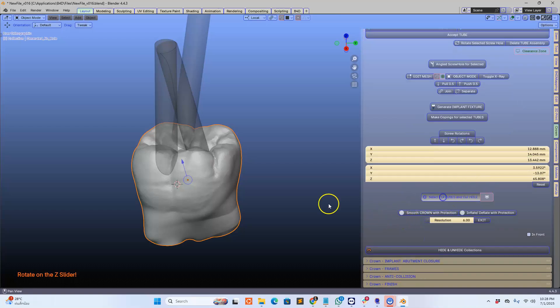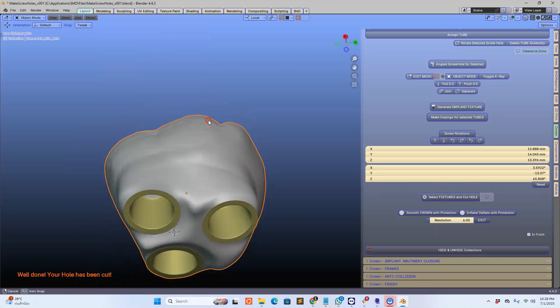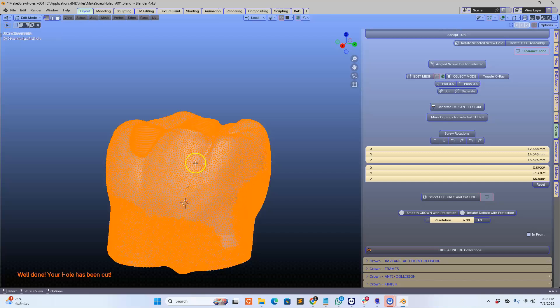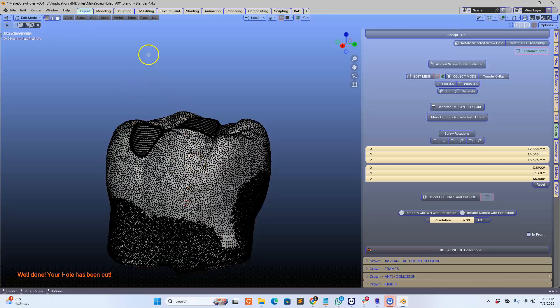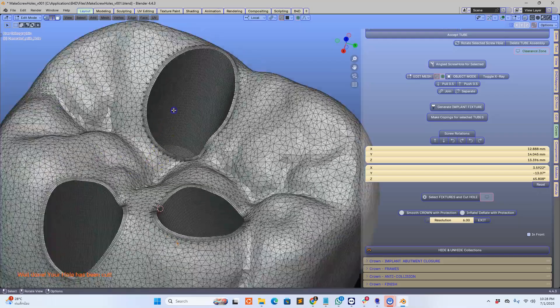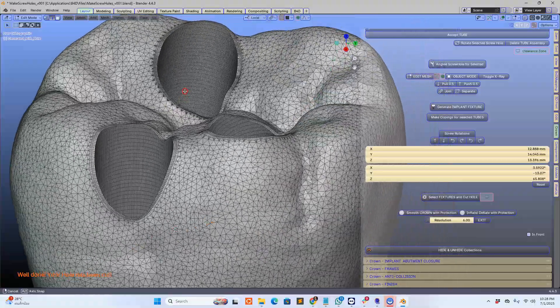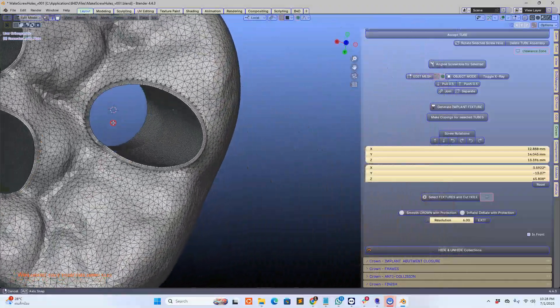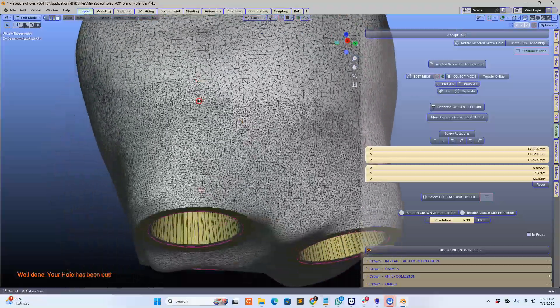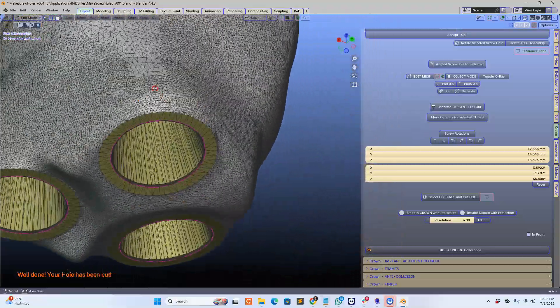Let's see if this works. Wow, how amazing is that! I want to see the mesh structure underneath it. Look how beautiful the Blender 4.4 dental mesh structure is. Absolutely, absolutely amazing.